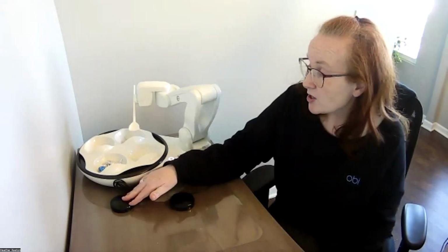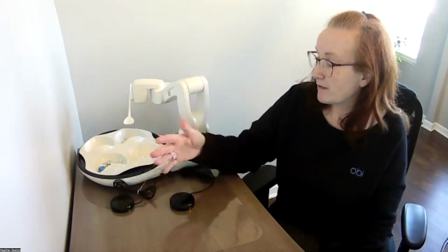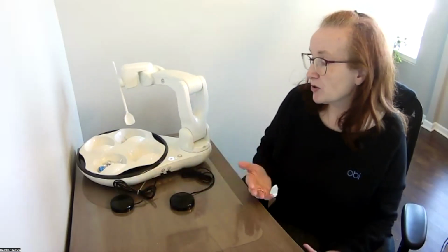From there, you're able to use the switches to choose what you want to eat. When you get above the one you want, the other switch will take a bite. You'll notice Obi scoops, will wipe the bottom of the spoon so if it's a liquid, it's not dripping, and then brings it to that preset location.